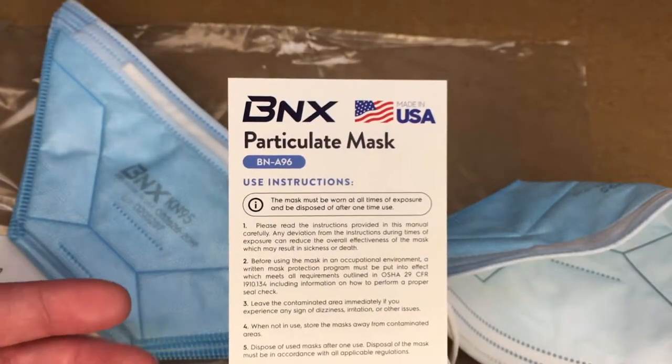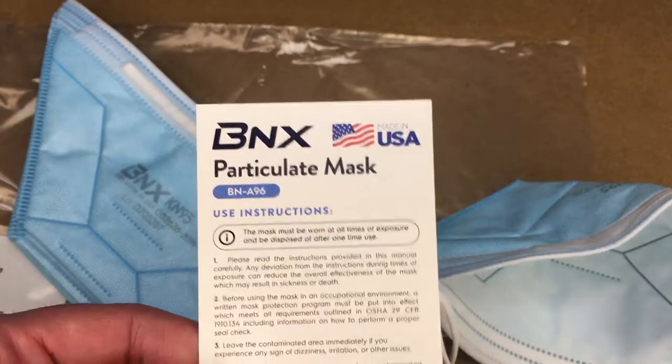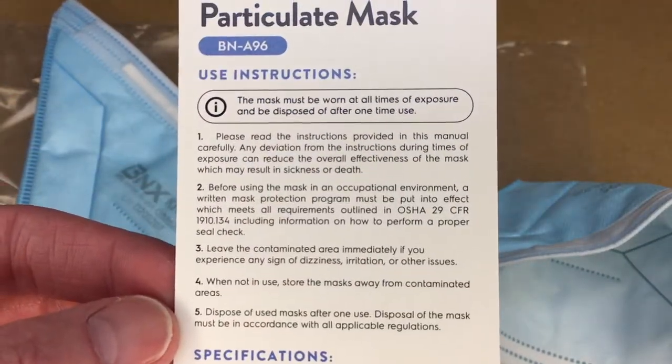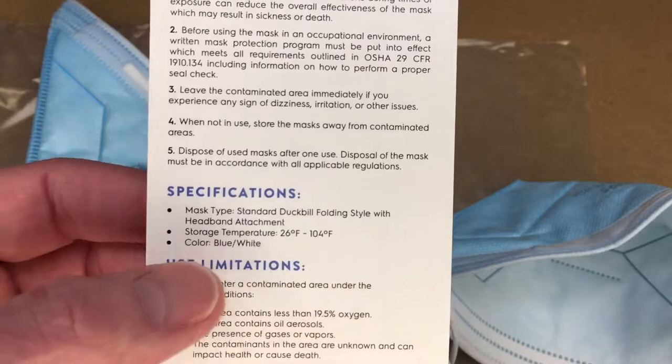One thing that may be of interest to people in the United States is that these are made in the USA — specifically in Houston, Texas. A lot of these types of devices are imported, so it's nice that these are made locally. It has user instructions on the packaging; I'll hold that up if you want to read them, you can pause the screen.